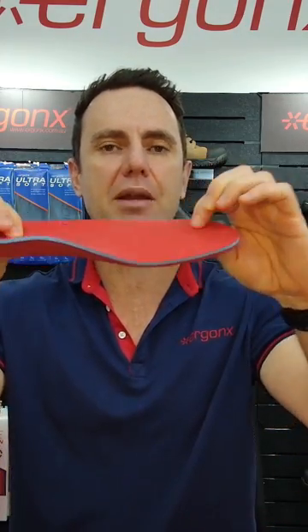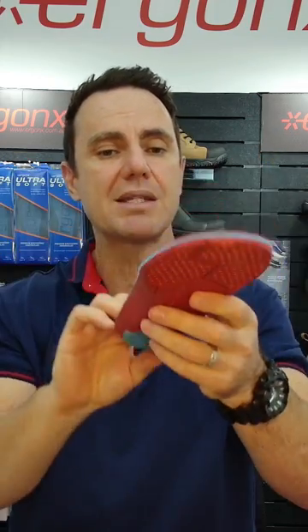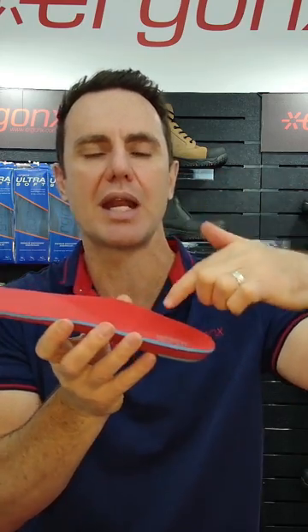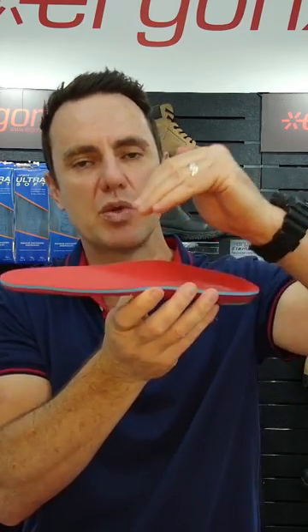This insole is ideal if you're getting arch irritation but really want a premium feel to the inside of your shoes. It offers the maximum amount of cushioning and tremendous comfort. It's also fantastic if you're getting forefoot pain or pressure areas, or if you can't tolerate anything through the arch because you have a really high arch.